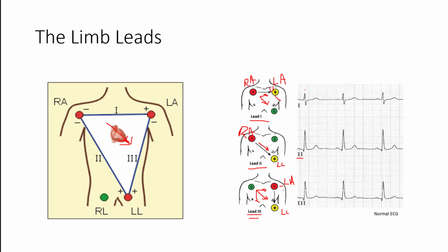There's more mass there, versus looking at the free wall or the lateral wall of the heart. So again, lead 3 will be larger than lead 1 because it's capturing a larger amount of cells that are producing activity in those ventricles. So it'll be smaller than lead 2 because it's not in the same direction, but it'll be a little larger than lead 1, even though it's only capturing some of that vector as well, because the part that it's capturing is producing more activity.